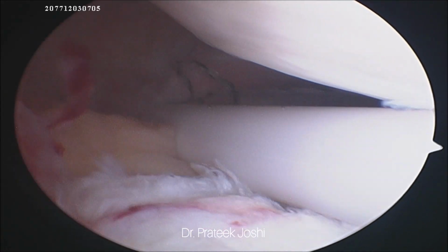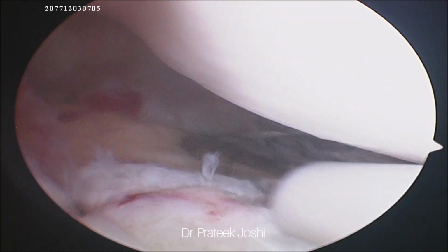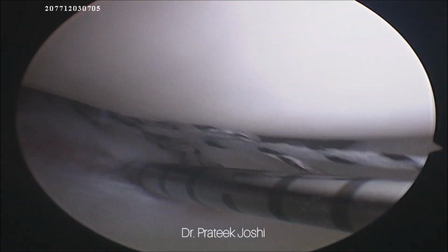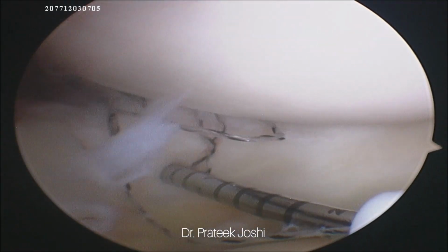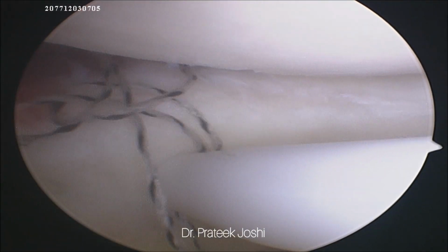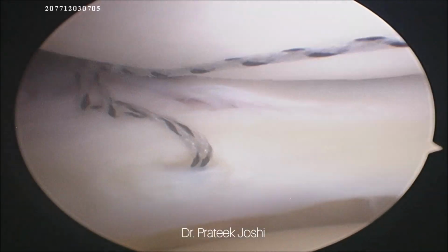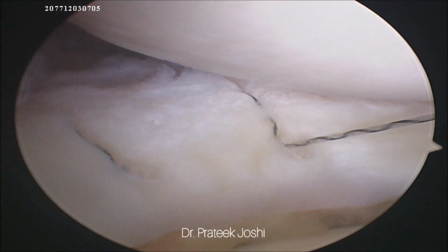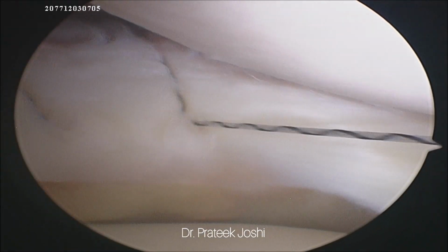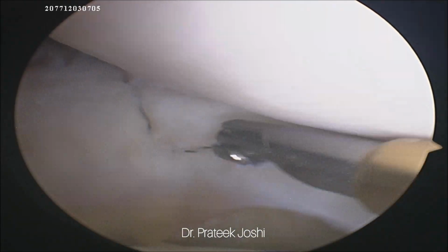We should be very careful because there are neurovascular structures right posterior to the capsule, so we should keep the needle length to less than 20, and we should just pierce as much as it's required to pierce the capsule. And now I have passed my second implant through the substance of the meniscus and I have tightened the knot, and this completes the repair of the posterior horn of the lateral meniscus.